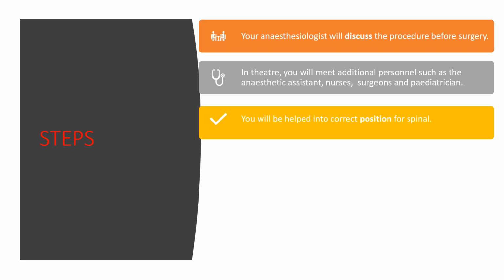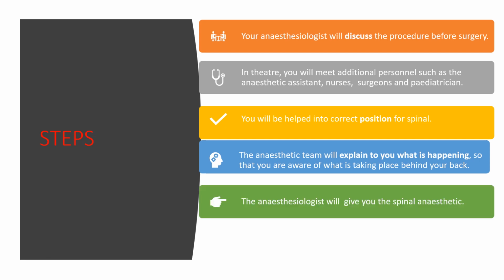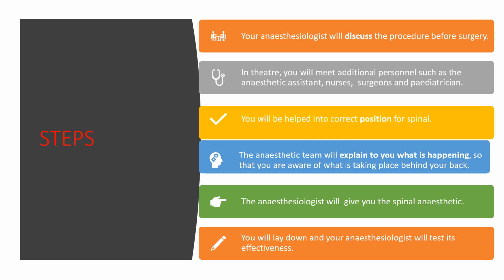You will be assisted into the correct position for the spinal. The anesthetic team will explain what is happening behind your back. The anesthesiologist will perform the spinal. You will then lay down and the effectiveness of the block will be assessed.